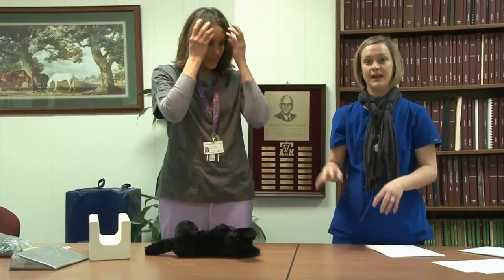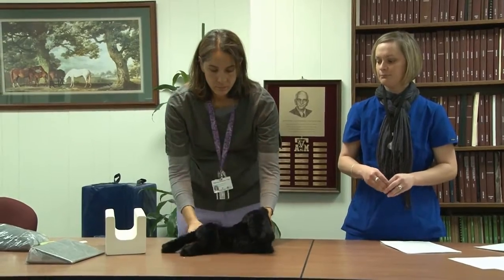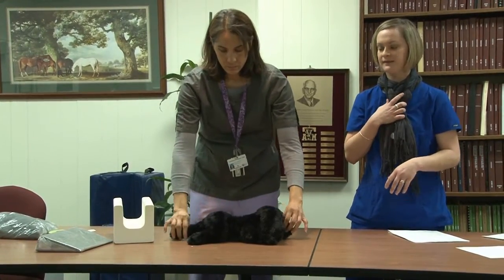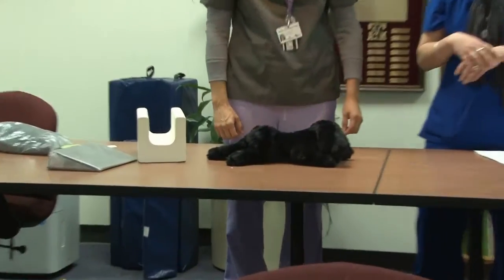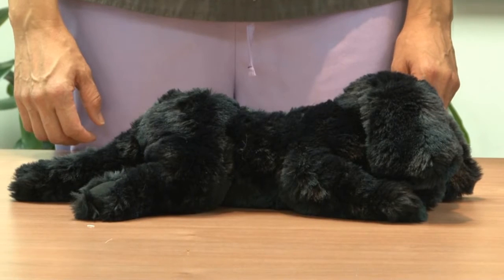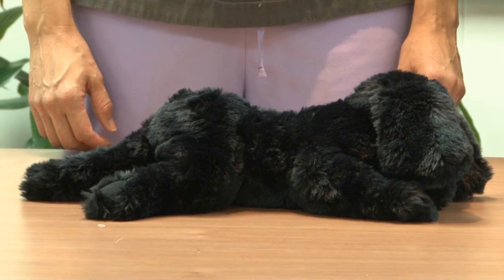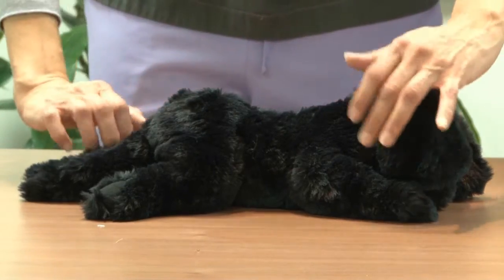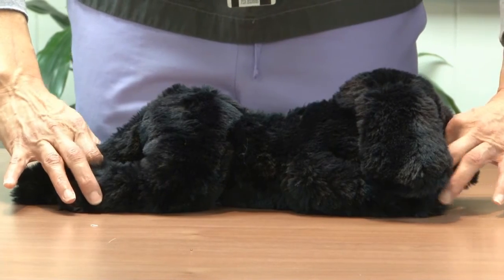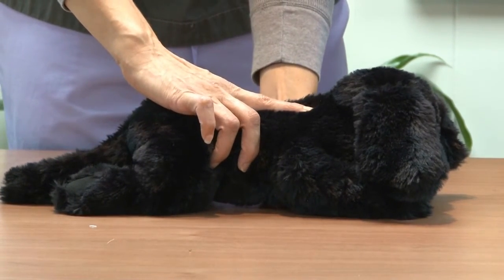Next we demonstrate a dorsal ventral thorax. We do these mostly on cardiology patients that have heart problems — it helps visualize the heart a little better. If they lay flat on the radiology table, you don't necessarily need a trough. Extend the front legs forward and the back legs caudally, and feel along the sternum and spine to make sure they line up perpendicularly with the table.